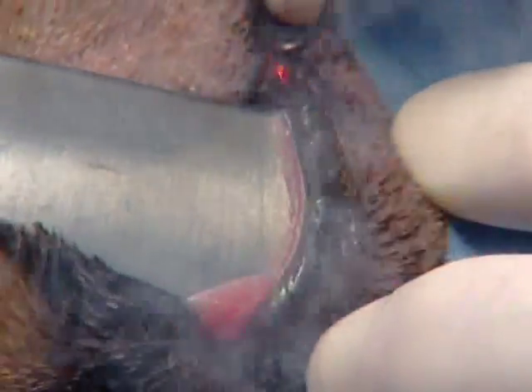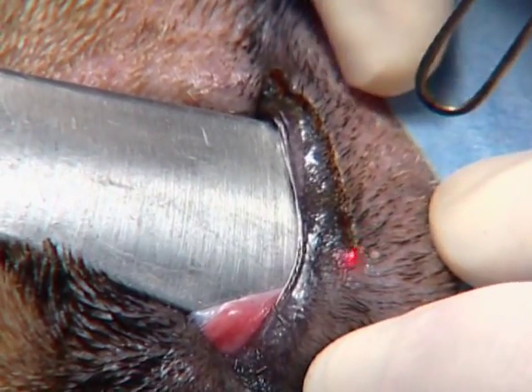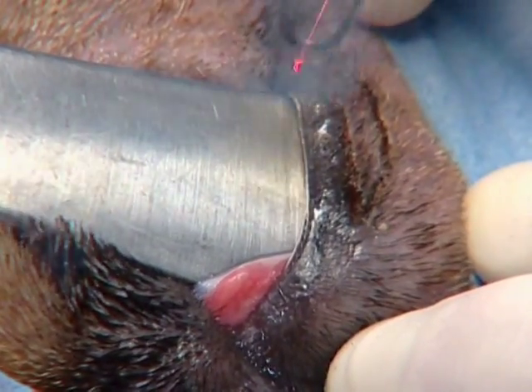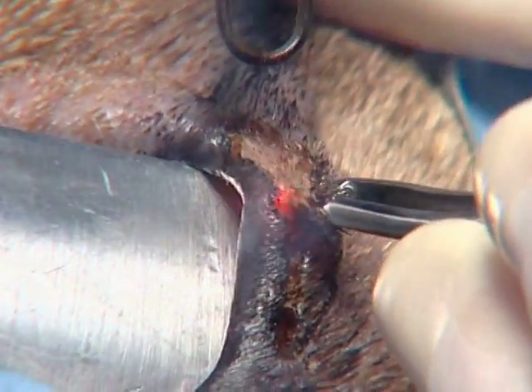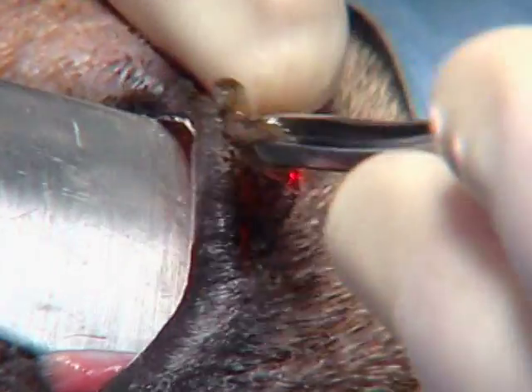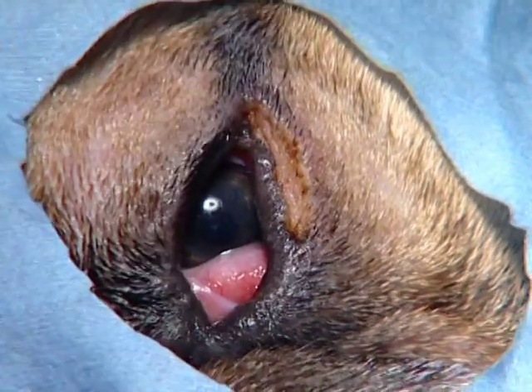It's probably not going to be quite full thickness, and that's okay. I do a free hand, so I'm just going to take a small smile out. Now I'm going to actually be changing the angle of my laser, going back and forth across this tissue, following the pattern that I started. Anyone who has done this procedure with the scalpel knows that by now you've gone through about four or five sponges. So we'll suture this in place, and then we'll do a touch on the upper lid.